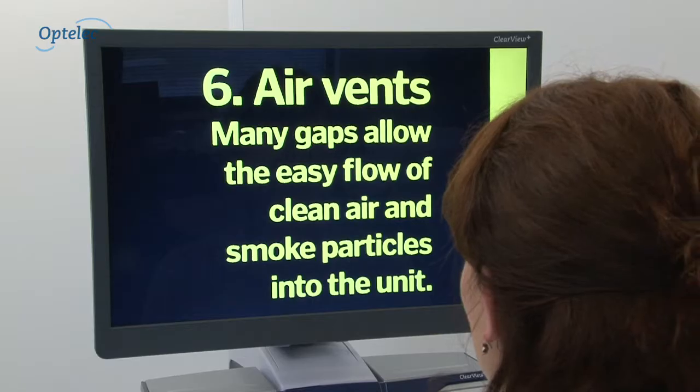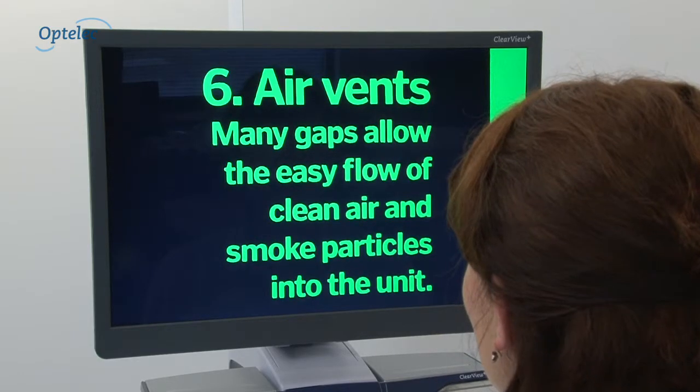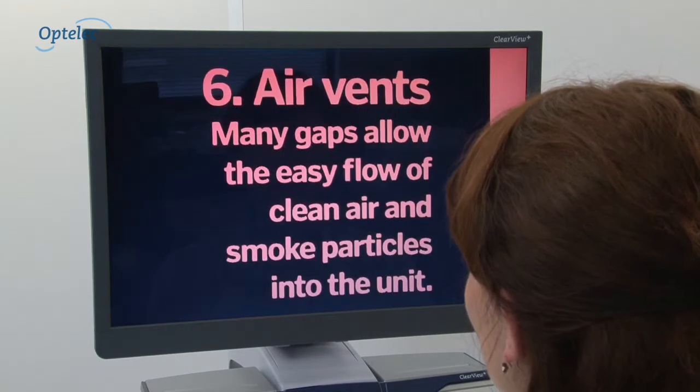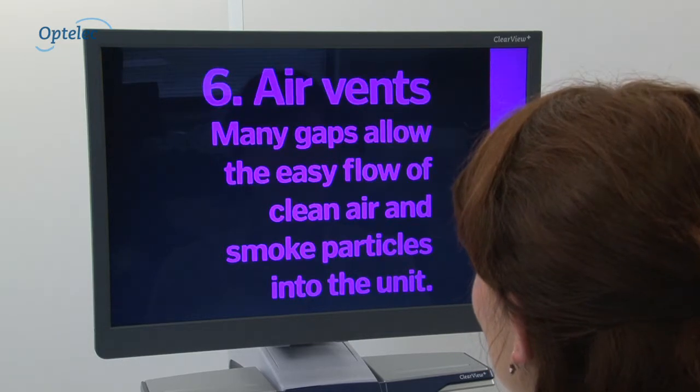Furthermore, with a basic feature pack, you can read in high contrast by choosing from one of the 16 different foreground and background color combinations.